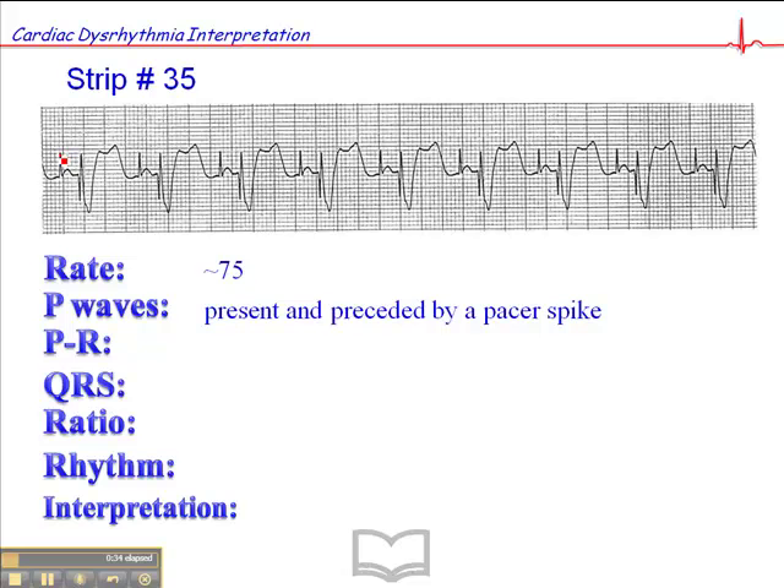This particular rhythm came from a rhythm simulator. Pacer spikes usually typically look more like just a straight line, then a P wave, and then another straight line followed by a wide QRS complex. Because this is a dual chamber pacemaker, we have a pacer spike followed by a P wave, then a pacer spike followed by a wide QRS. The QRS will always be wide because the impulse generator has a wire that goes into the right ventricle and paces the ventricles from there — right ventricle depolarizes first, then the left ventricle, so we always get a wide QRS with a paced rhythm.